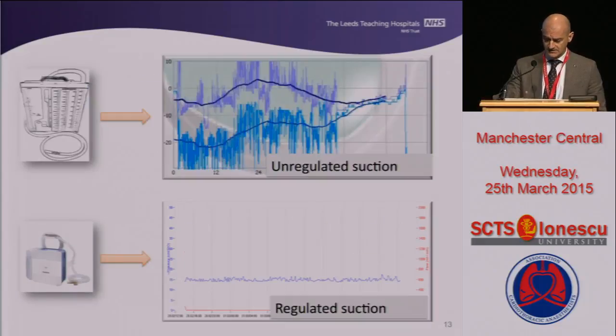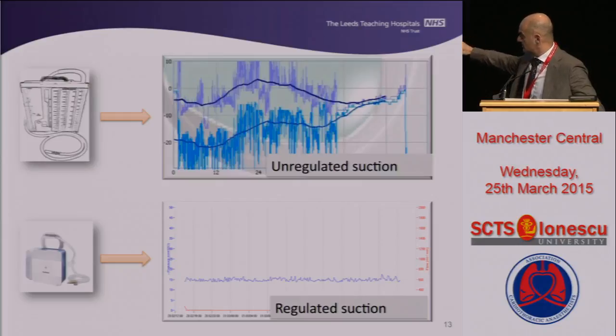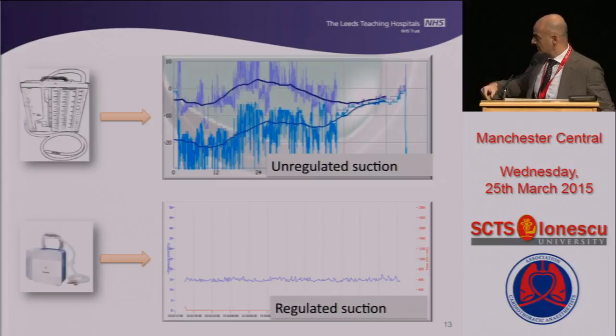And this is not what happens when you apply an unregulated suction. When you plug your traditional device into the wall suction, that is completely unregulated. Even though the patient is on suction, you see the oscillation in the pleural pressure curves, and with regulated suction the pleural pressure is very stable. The blue line is the actual pressure measured at the chest. It's not inside the chest, but at the chest, because the pressure sensor is close to the chest. But I think it's a reliable approximation of the average pleural pressure inside the chest, and it's very stable with very narrow oscillation.